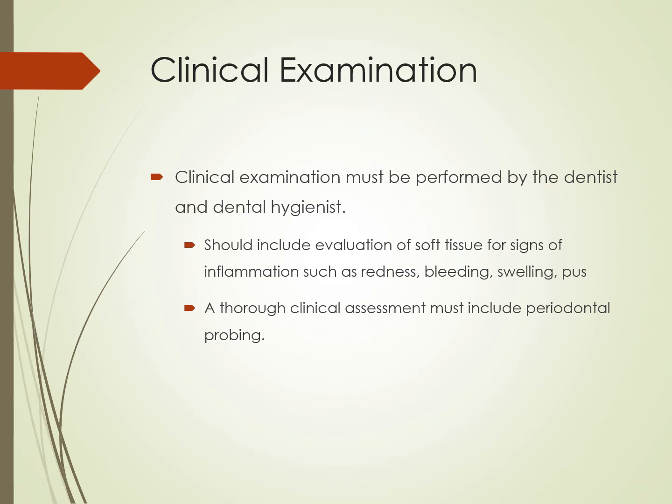So this is going to happen to you guys in clinic. Maybe at a different angle, or something crazy is going to happen. You're going to say the pocket is one thing, and we're going to look at the x-rays, and it's going to be like, well, maybe the pocket isn't really what you said it was. That's okay. It's part of learning. But it takes a lot of time. There were times in private practice where I'd get a 3 because I was not quite in there. And then I'd look at the x-rays and I'd see, oh man, there's a lot of bone loss there. So then I would go back and double check myself, and I'd be like, oh yeah, that's not a 3, that's a 5 or a 6.